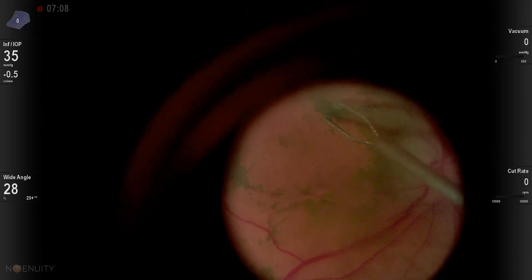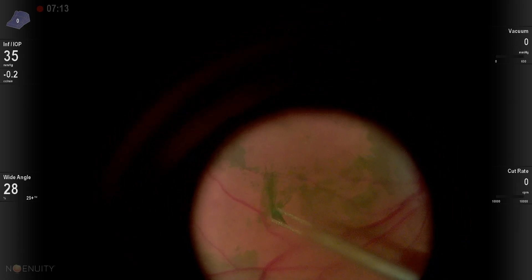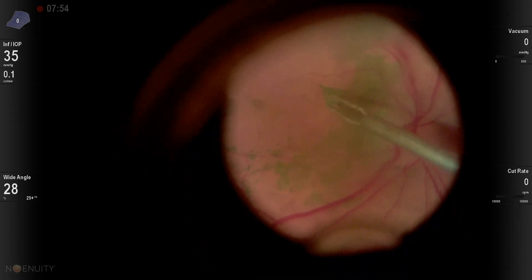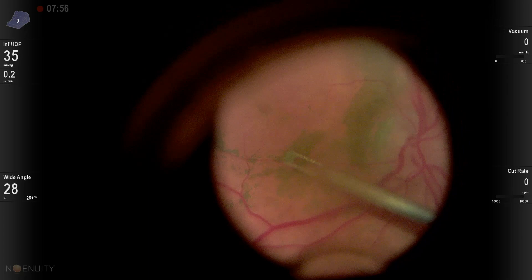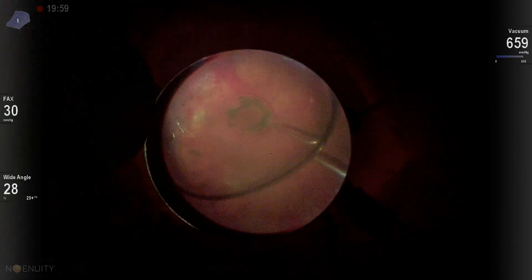I get my ingrasping forceps and I'm able to safely grab this ILM and peel it over into the epiretinal membrane, peeling the ILM out around and through the area to make sure we don't have any recurrence.